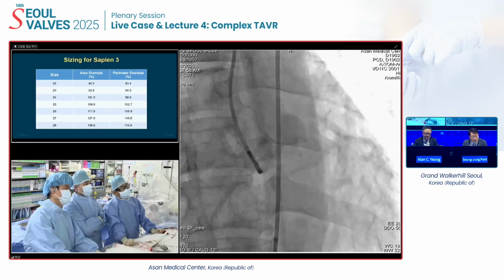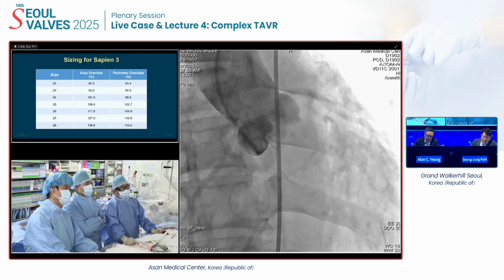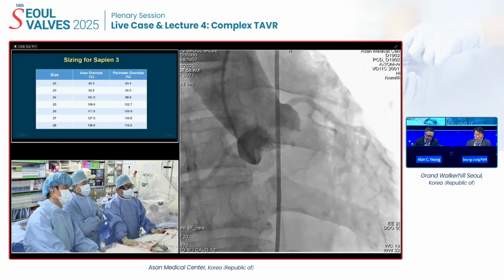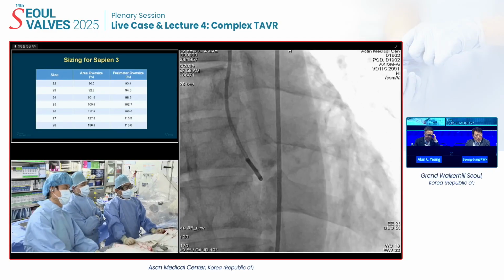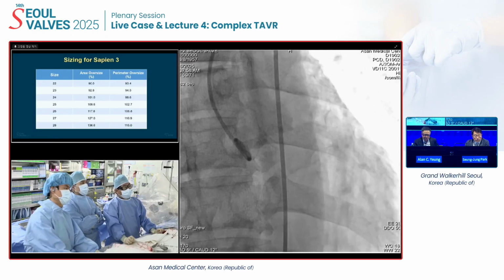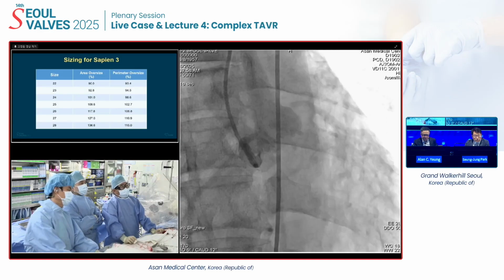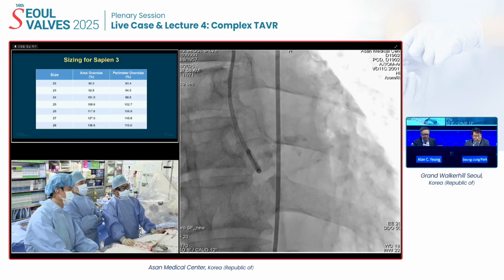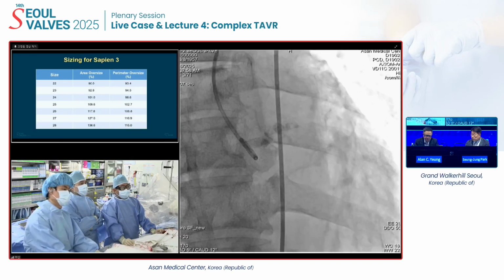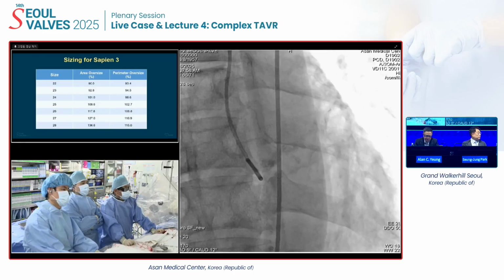If a patient has low annular calcification and tricuspid anatomy, I'd like to choose the 26 and a little bit of underfilling, but considering bicuspid anatomy and a heavily calcified aortic valve, I'd like to select the 23 and 1 cc overfill. Even though this patient has bicuspid aortic stenosis, the calcium morphology is not that dangerous, I think.